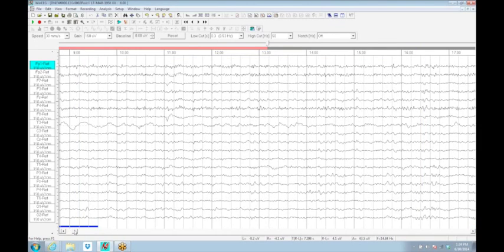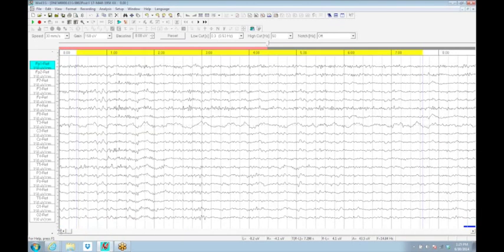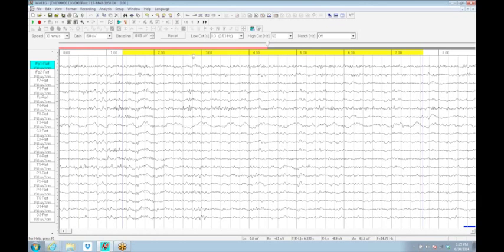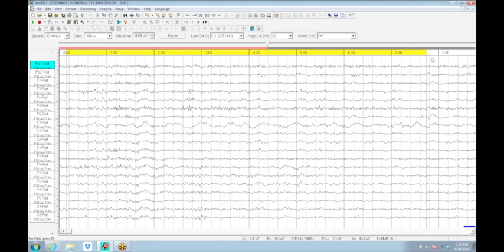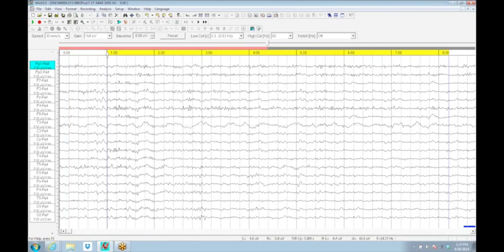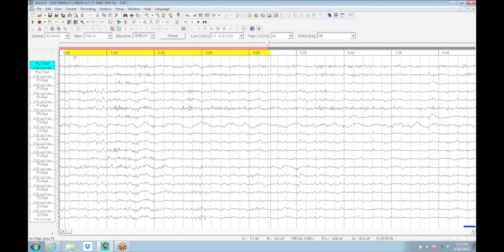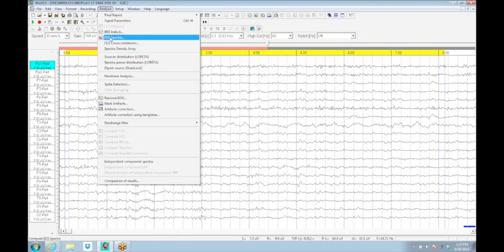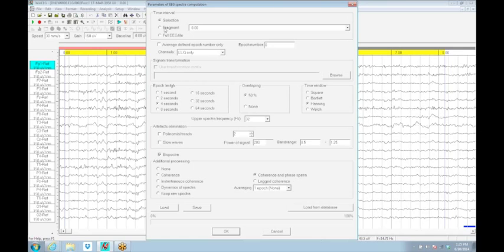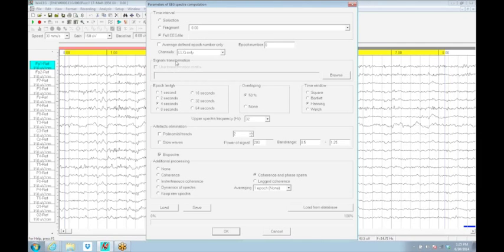You're making that selection by right where that's working. I left mouse click on the timeline to catch the left edge and I right mouse click to catch the right side edge. Clicking down here doesn't do that. It has to be up here on the timeline. I can extend that out or shrink that down to focus on a particular piece. Once I have the piece selected, I can analyze that piece or the fragment if it's predefined or a full EEG. Everything other than the pieces I have set aside, the blue underlining, will now be analyzed.